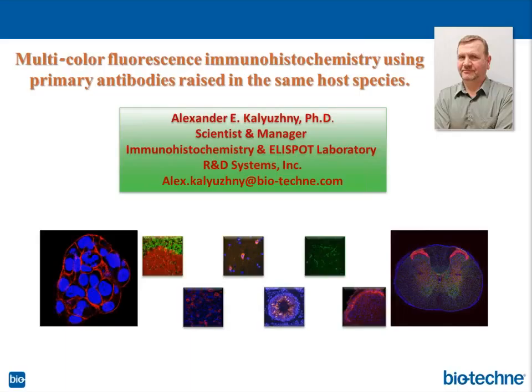Okay, and then Amir asks again, how would you quench transgenic fluorescence signals to be able to restain in the same channels on a frozen section? Well, it depends what technique you're using. If you're using the TSA technique, you cannot quench the signal.